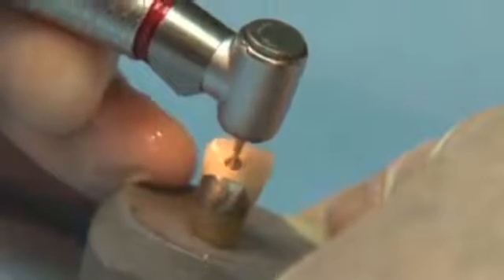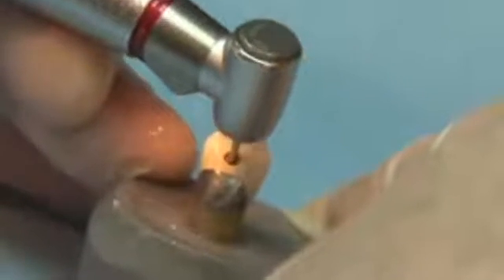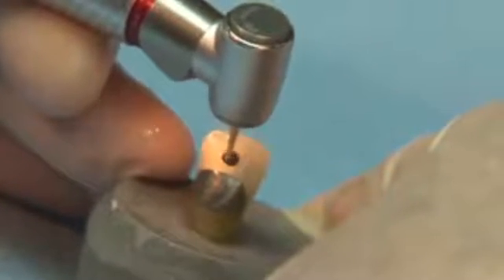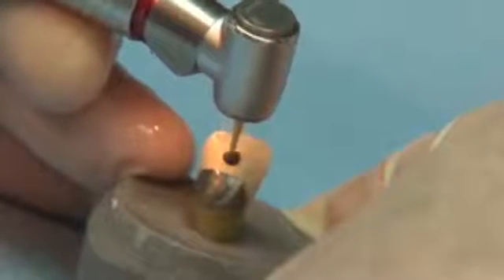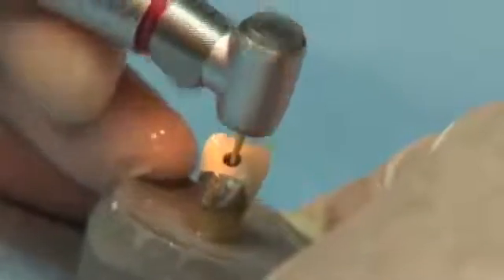SS White offers a selection of surgical length Great White Burrs. These burrs are available in round numbers 2, 4, and 6, as well as the ever popular number 557. The added length improves visibility and allows for deeper access.